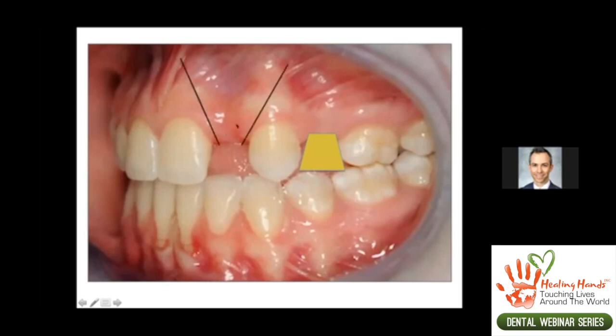There have been many different incision designs described. One of the incision designs is this one, where it's papilla sparing, and you have to be very careful when you incise and elevate not to elevate the papilla, because when you make these incisions, the papilla, to survive, must stay attached to bone. Otherwise, it starts becoming blue and kind of congested looking. So this would be really ideal. You want to give it at least a millimeter and a half. And this type of incision design is fine if you're just trying to build up a little bit of bone in the labial concavity here for the implant, but it does limit you quite a lot.